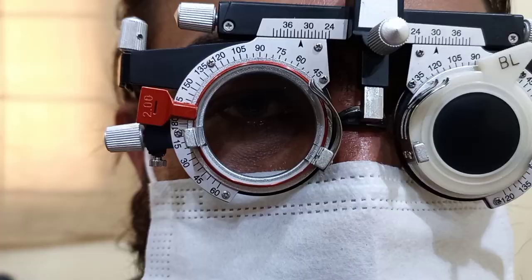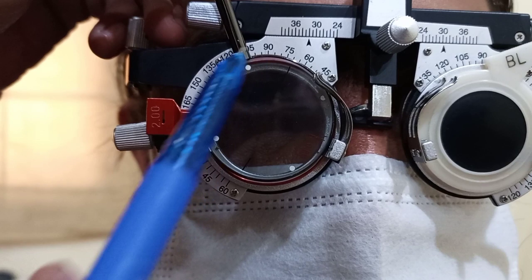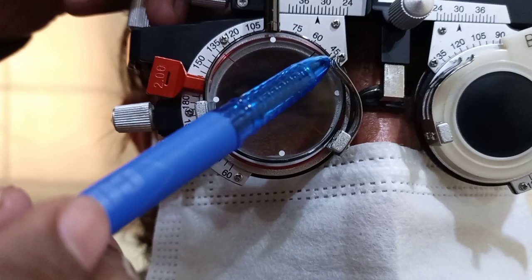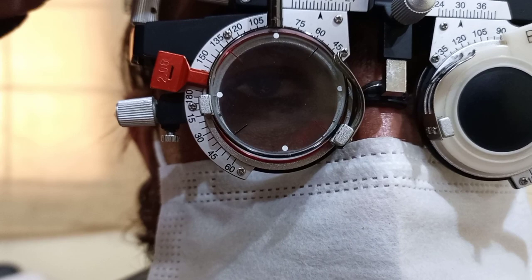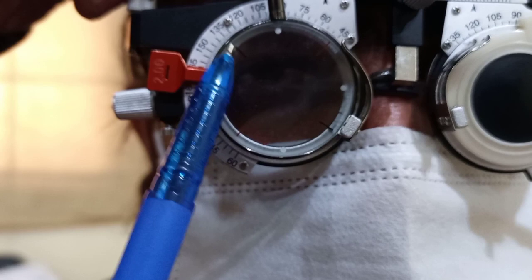For bracketing, we place the handle of the Jackson cross cylinder at 90 degrees. With the handle at 90 degrees, the red line of the minus cylinder axis is coinciding with 135 and the plus cylinder is coinciding with 45 — this is position number 1. When I flip the Jackson cross cylinder, the minus line is at 45 and the black line of the plus cylinder is at 135 — this is position number 2. Now we will ask the patient which is better.